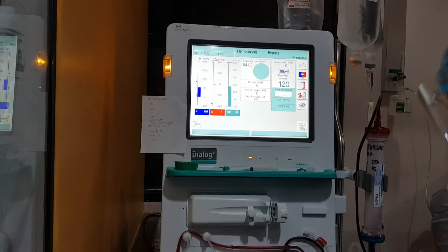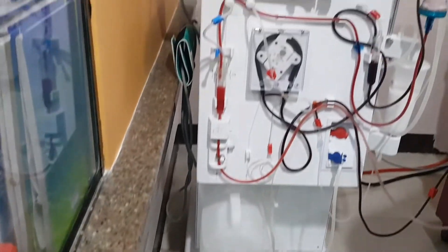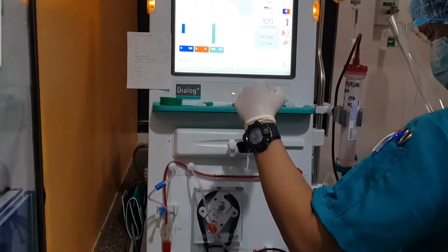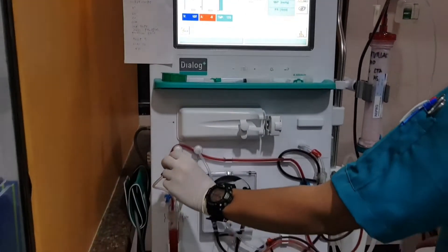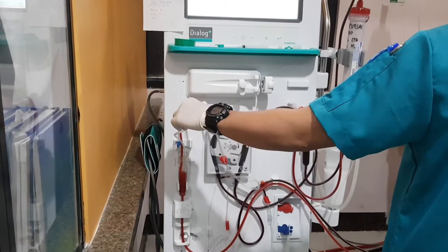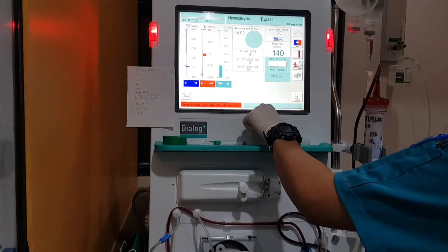Mute the alarm. Connect the venous line to the venous port. Open the big blue clamp and venous port catheter clamp. Then start the blood pump. Open the venous transducer clamp. At this stage, the venous red sensor will sense no blood and will alarm due to the presence of saline. Acknowledge the alarm until it stops. If not, try to slowly increase the blood flow rate.